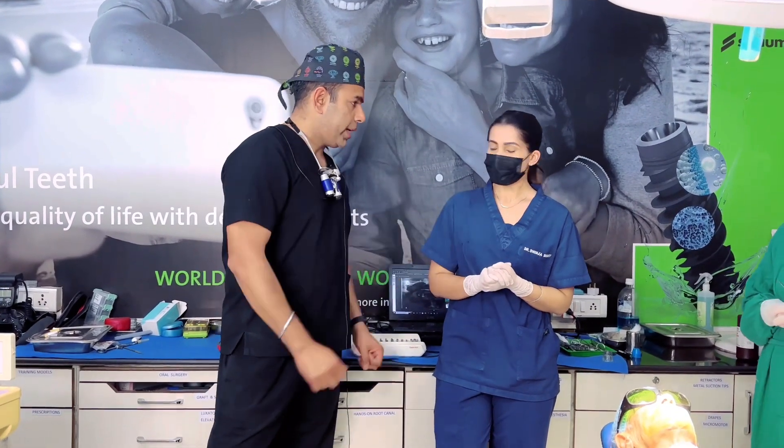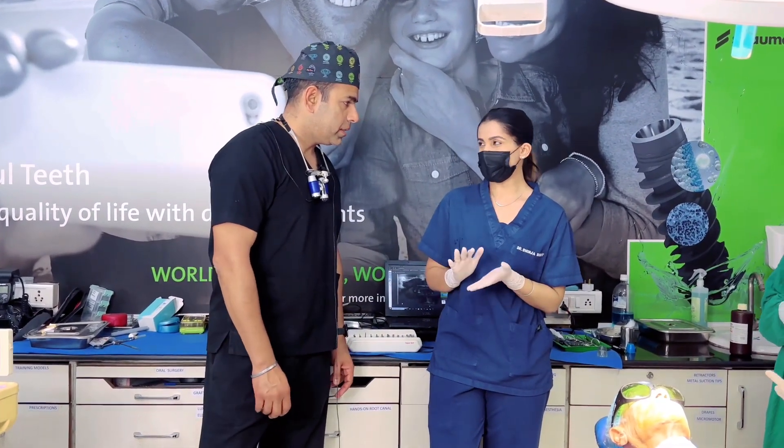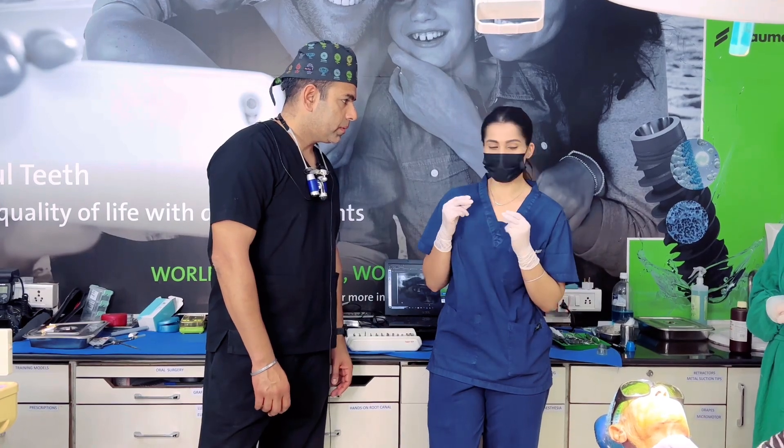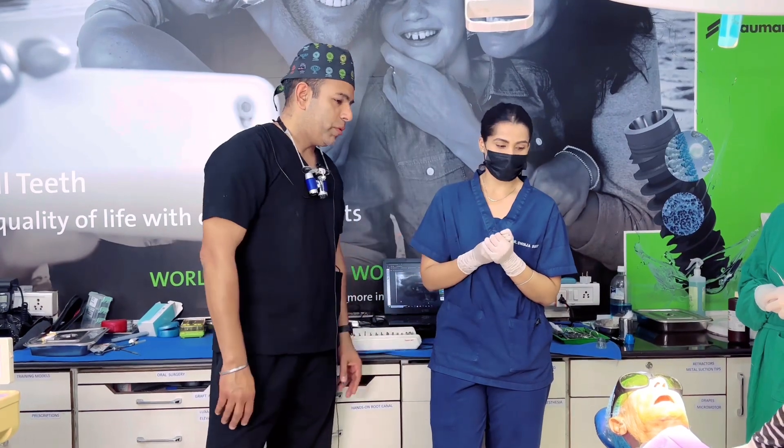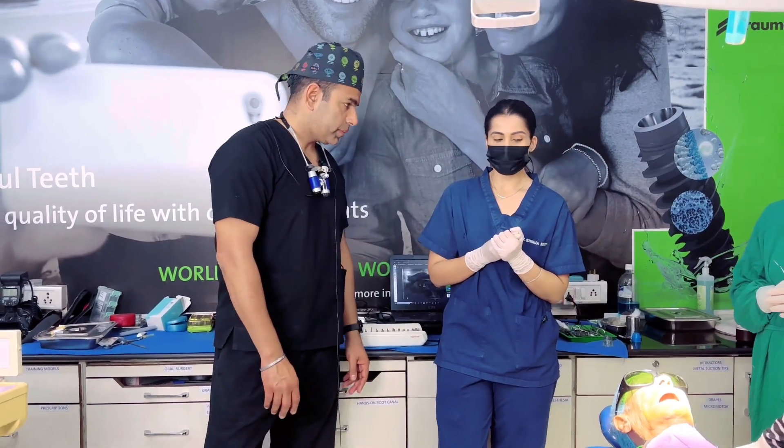How was her case? It was very swift — placed it like just in a jiffy. I am placing on a 92-year-old young man, so I have to be very, very quick. Very swift, and the patient was so comfortable all throughout.